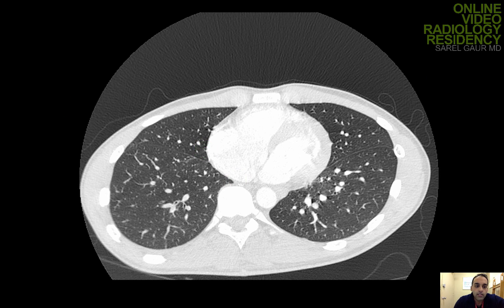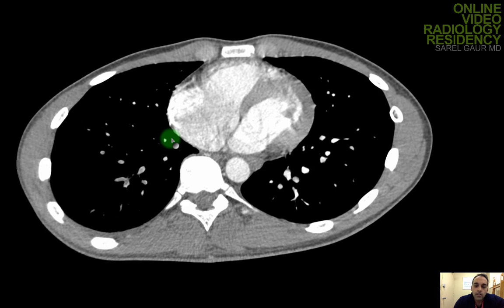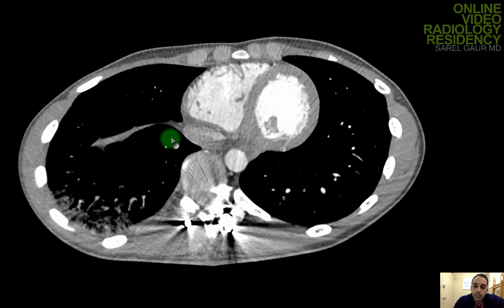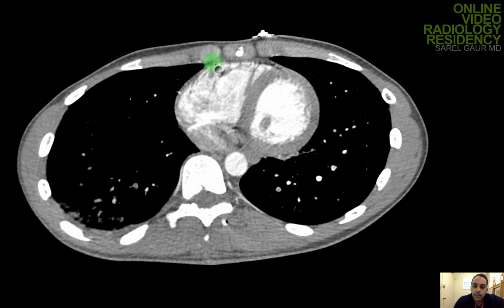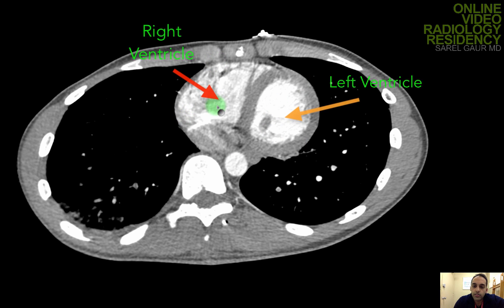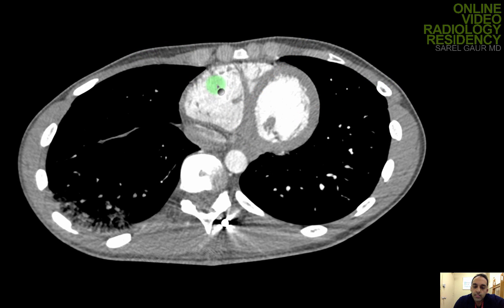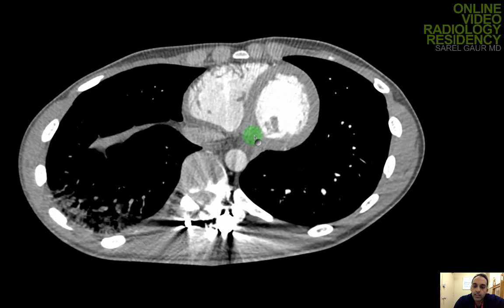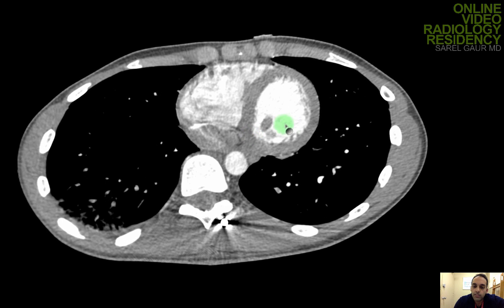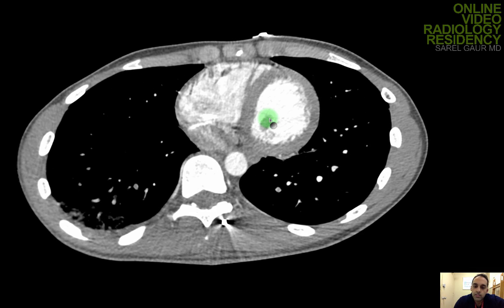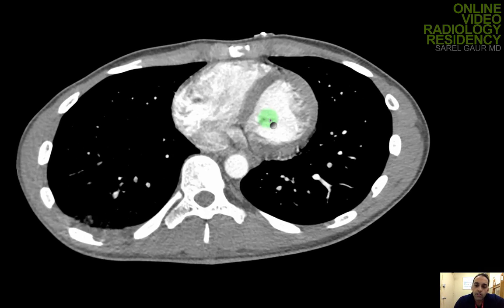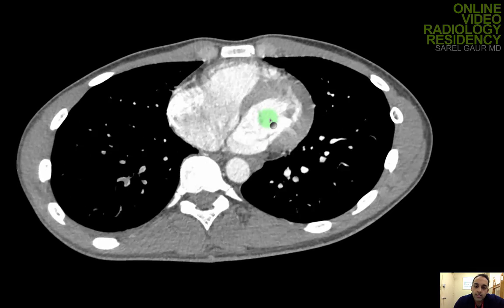Another thing to look for is whether the clot is large enough to put back pressure on the right ventricle, causing a right ventricular strain pattern. I'm coming down to look at the heart — this is the left ventricle and the right ventricle, with the intraventricular septum between them. I want to see if the right ventricle is bowing the septum from right into the left ventricle. It looks like the septum is still convex from the left ventricle out into the right, so that's a normal relationship — no evidence of right ventricular strain.